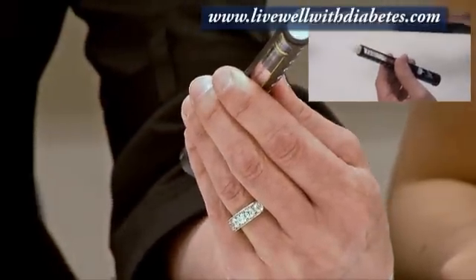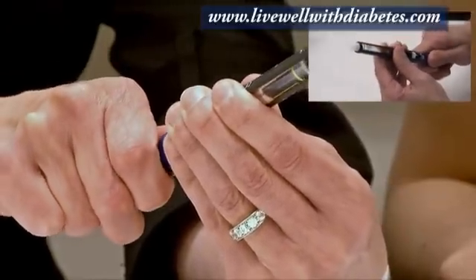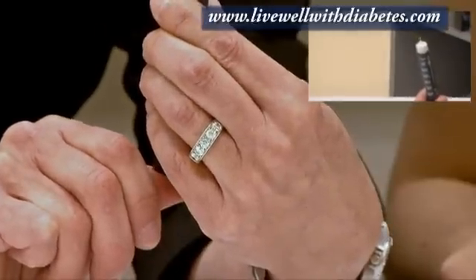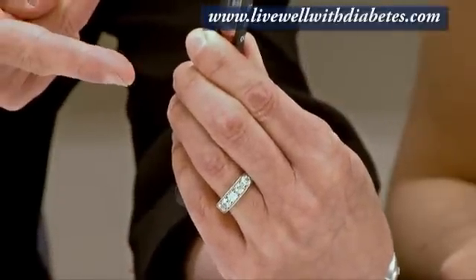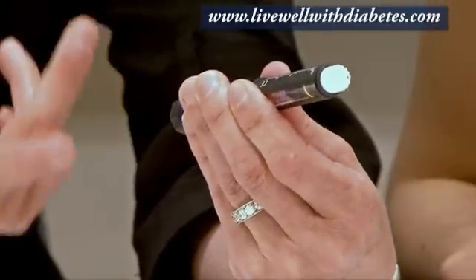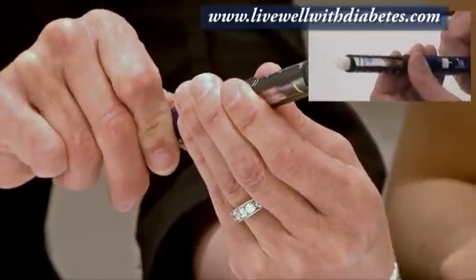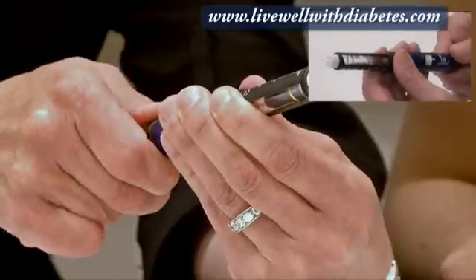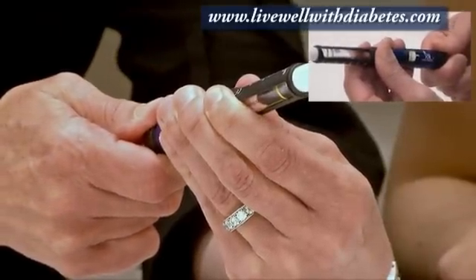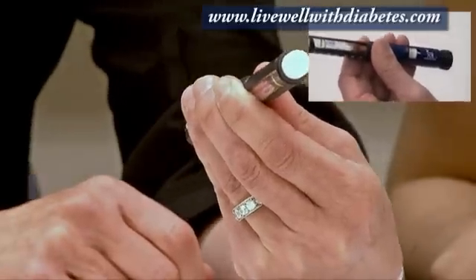For your next injection, to do the check you dial to number one. Point the needle up and push the button — you see a drop of insulin come out, and you know everything is okay. Then pull the button out and turn it to your dose. Dial to eight — there's eight — and it's ready for the injection.